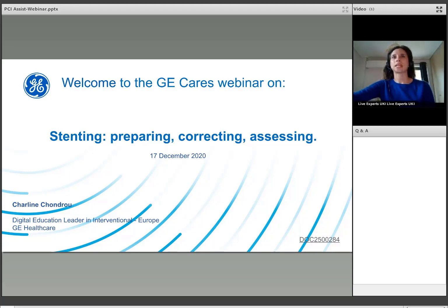We will be talking about stenting. We'll be talking about the tools that GE is providing to give you as much information as possible when you're placing stents. It will be about preparing how and where to place the stent, correcting if you realize you're about to place the stent in the wrong position, and then assessing once you have deployed your stent to see the results and whether it needs some optimization.